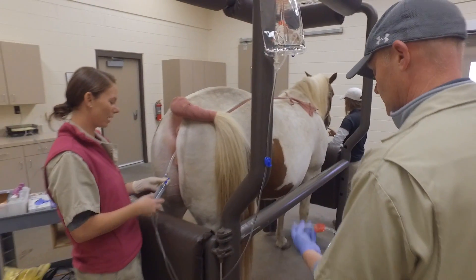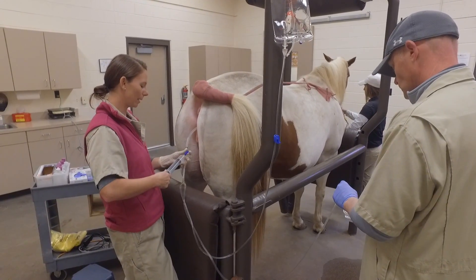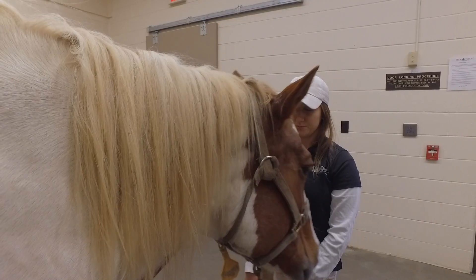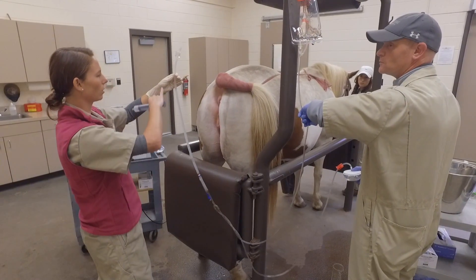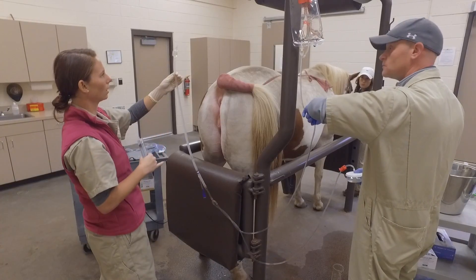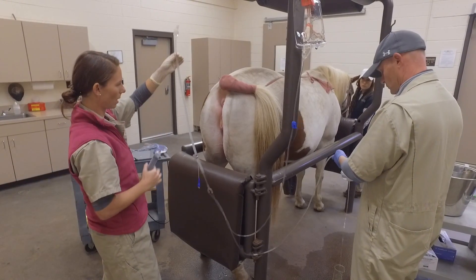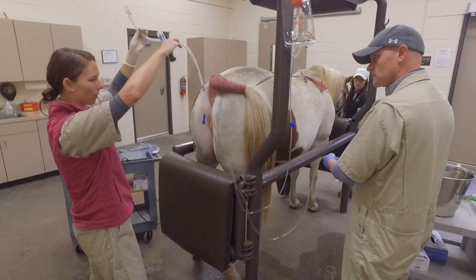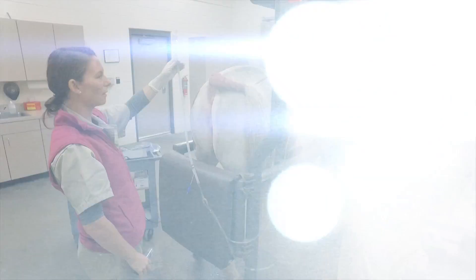So I'll go ahead and deflate my cuff, pulling out all the air and fluid that we placed into the cuff so it could stay in the uterus, and then I'll go ahead and remove my catheter. We'll run some fluid through just as high as we can, making sure that nothing overflows in case the embryo is up at the tip, and then we'll siphon it back through our embryo filter. We do this about three to four times with the amount of fluid we have left.